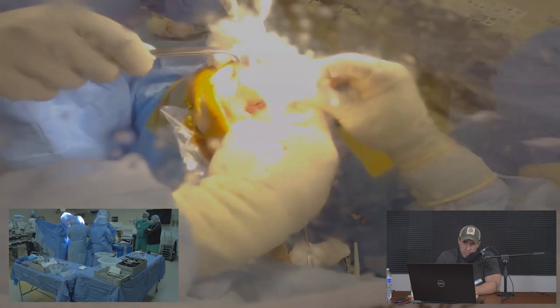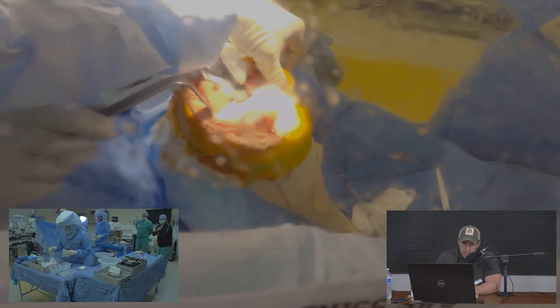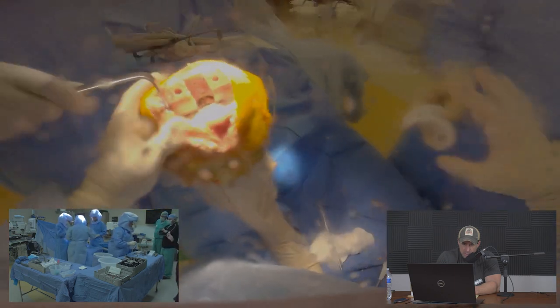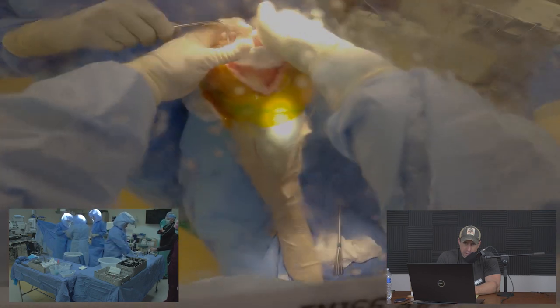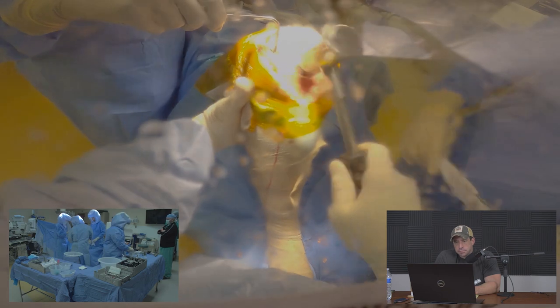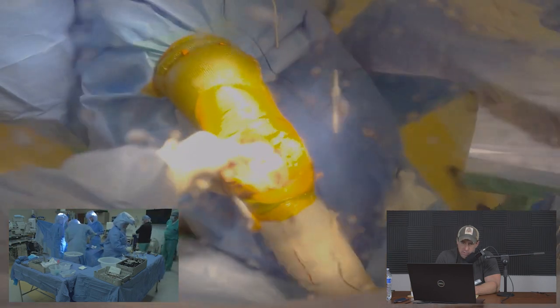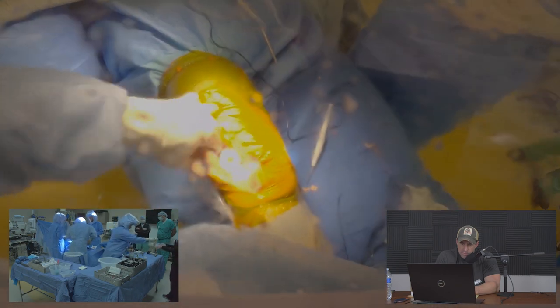Repositioning retractors to expose the tibia, we place a trial tibial implant — again a 3D printed disposable piece. Marginal osteophytes are removed and the femoral implant is applied once more along with the trial tibial insert, which is popped into position. We then assess the knee for full extension and stability by applying stress forces to check flexion and ligamentous stability.